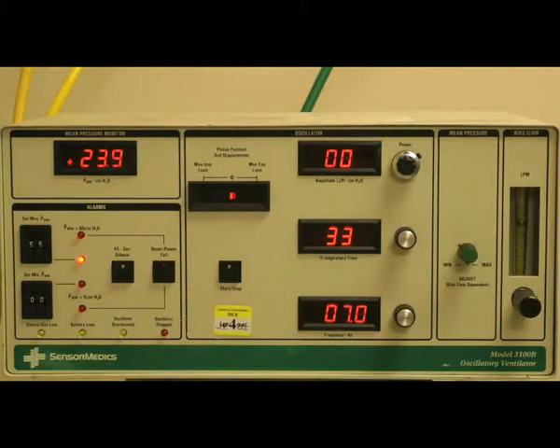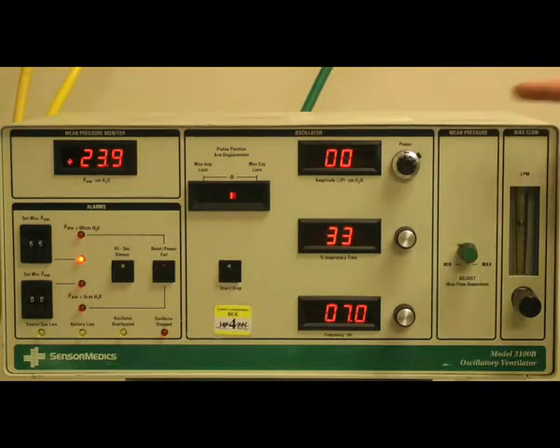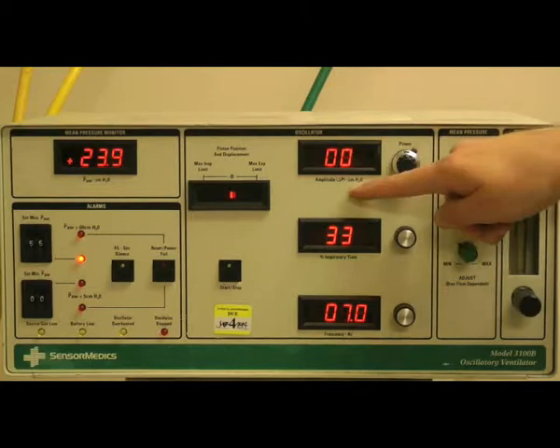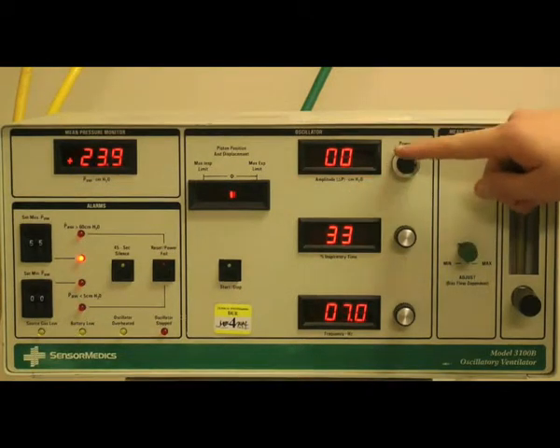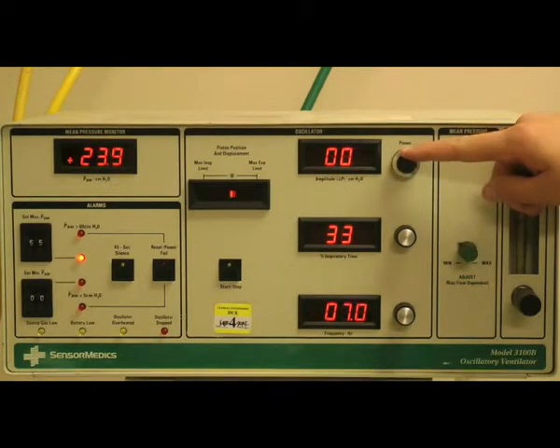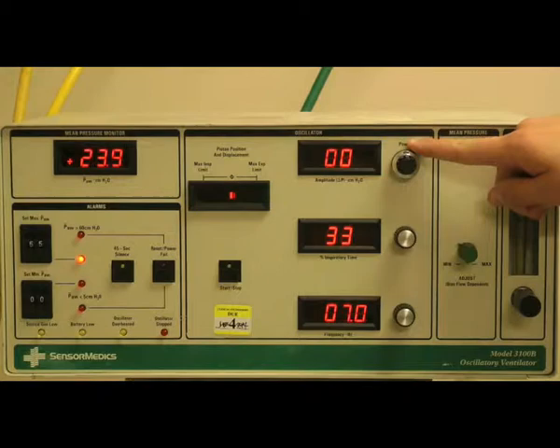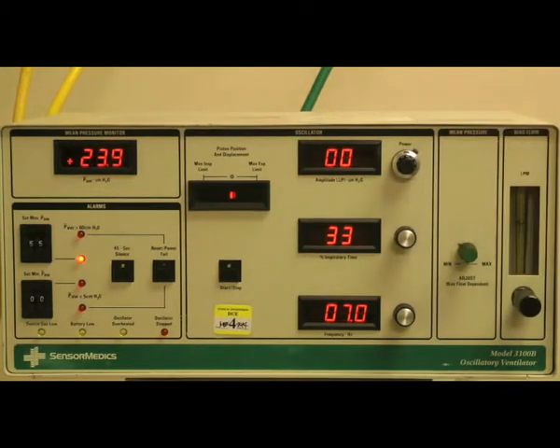When trying to affect a change in your acid-base status by either decreasing or increasing your pH, a secondary control for ventilation is your power, or delta P. The power is the setting that controls your change in pressure. As you increase your power, you'll increase your delta P, which can increase your ventilation, and of course vice versa. The lower your power, the more CO2 retention will occur.